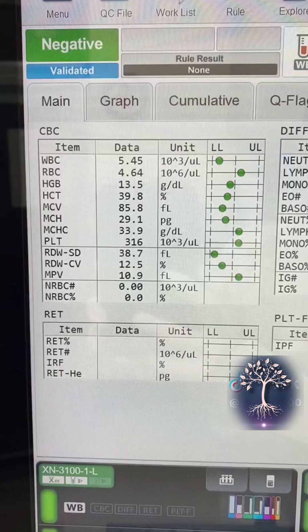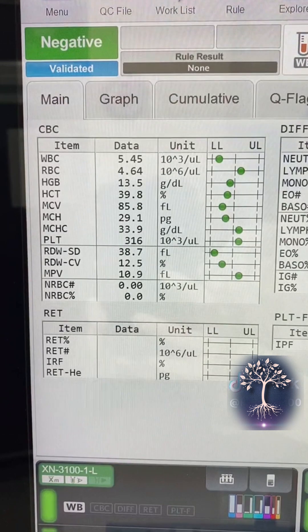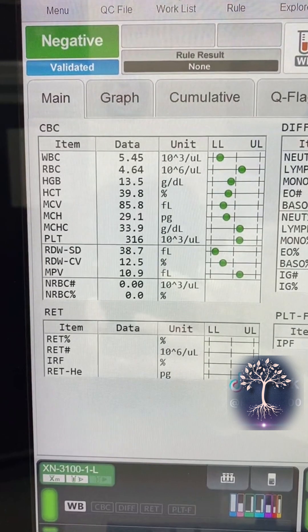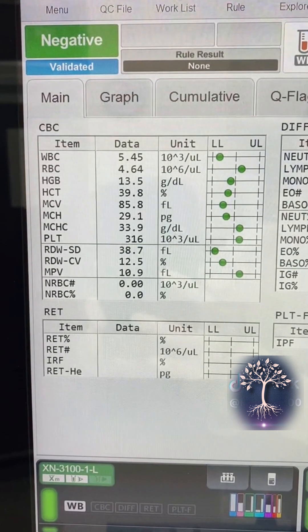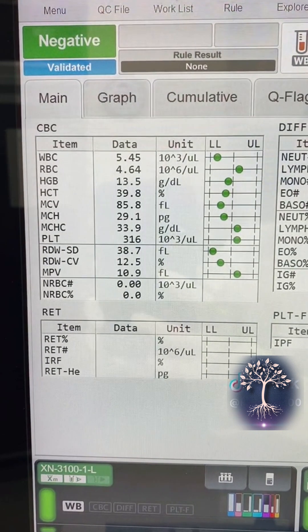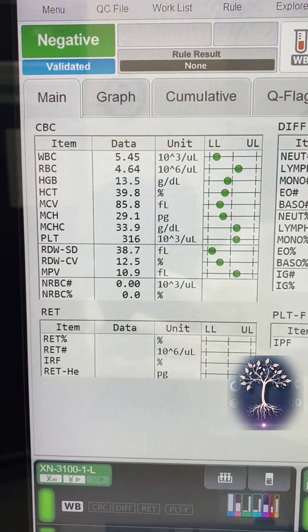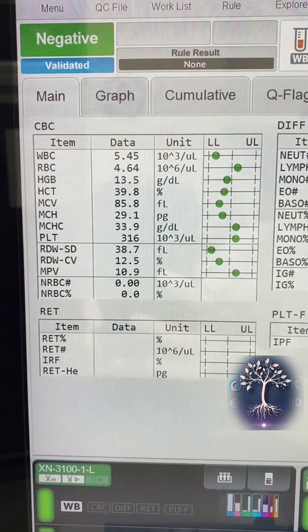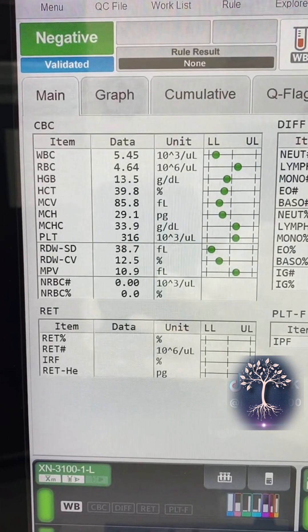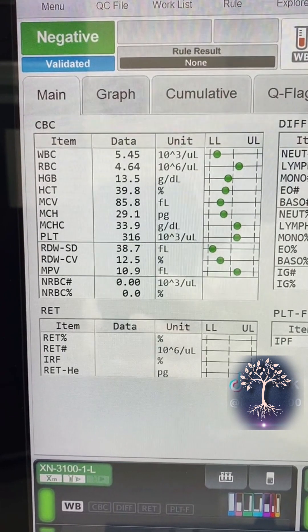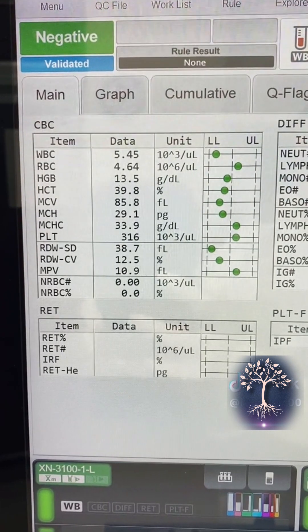Once the CBC is run, the results are transmitted to the computer screen attached to the XN. These are the results from a healthy patient, but first let's break this down so I can show you guys a little bit more of what all is inside of a CBC.